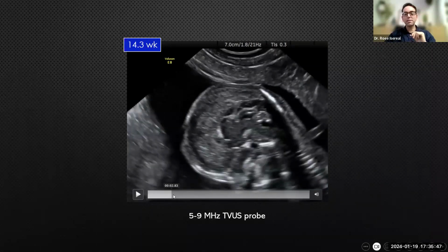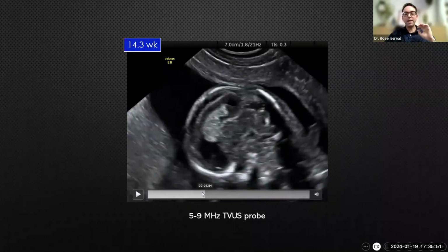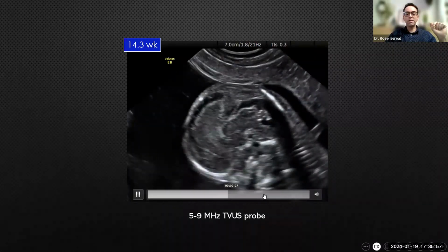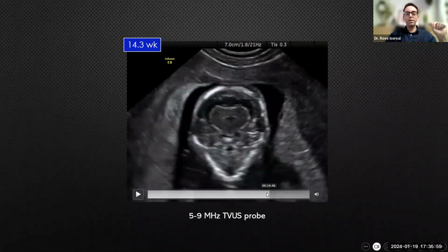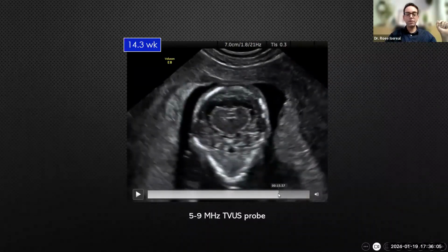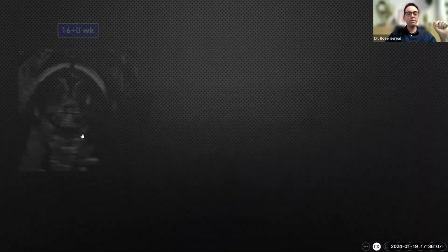You can clearly see these reflections along the midline, and then you're moving a little bit to the parasagittal plane, and then you see only the isoechoic hemispheres here, and you know for sure that the vermis is here. And if you rotate the probe 90 degrees, you can clearly see the early vermian fissures here along the midline, which you cannot see on the hemisphere. So bear this in mind when you're studying the midbrain and hindbrain.